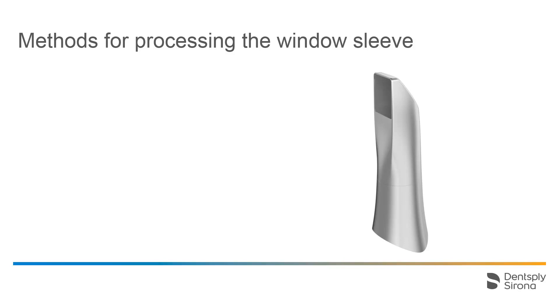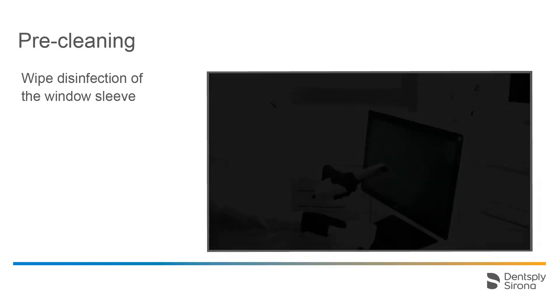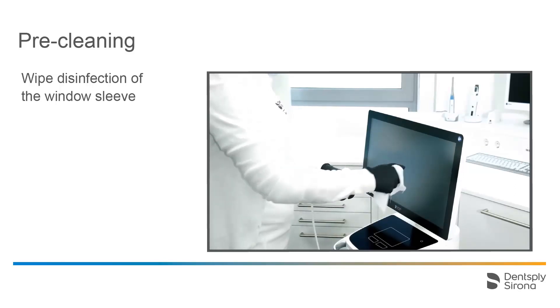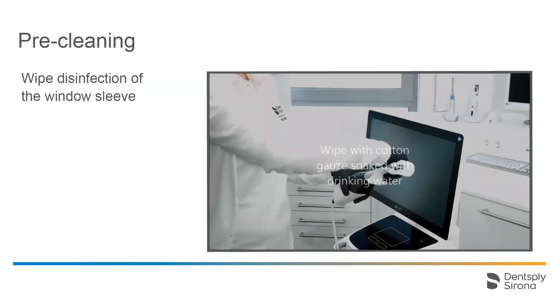The following hygiene procedures can be applied for processing the sleeve: wipe disinfection, high level disinfection, or hot air sterilization. Wipe disinfection consists of two steps: pre-cleaning and a repetition of the procedure. Pre-cleaning should be performed immediately after use to avoid the hardening of residues. We start the pre-cleaning procedure with wipe disinfection of the attached scanner sleeve. Use the materials approved for the processing of non-critical contact surfaces for this step as well. Please make sure to adhere to the treatment time as indicated by the respective manufacturer. Then wipe the sleeve down with cotton gauze soaked with drinking water.